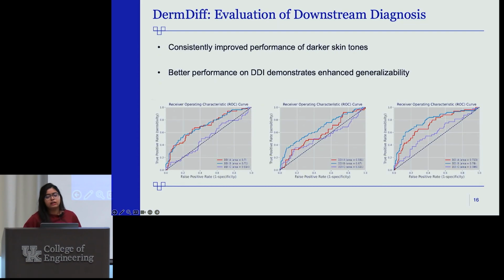And these are the AUC ROC curves for these three models. The left one is the result from the model trained with the Fitzpatrick dataset. The middle one is the result from the model trained with the ISIC dataset. And the last one is the result from the model that was trained with both real and synthetic images, and it has better AUC scores. So these are the findings from our first paper, first model.